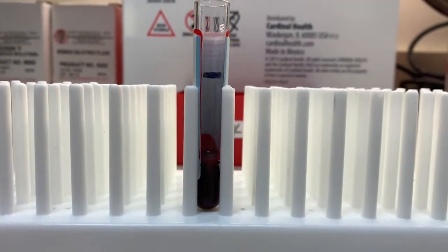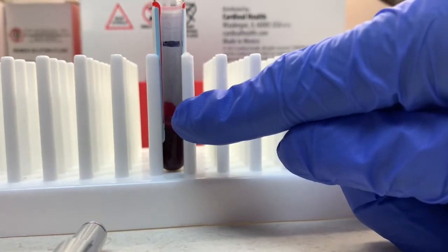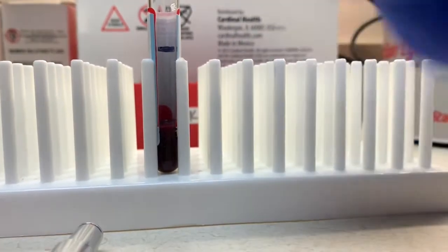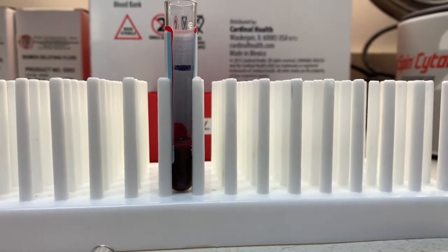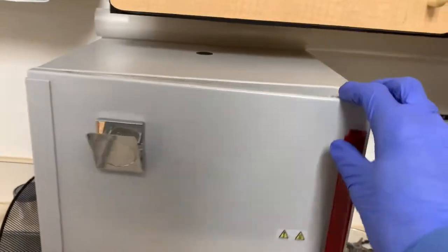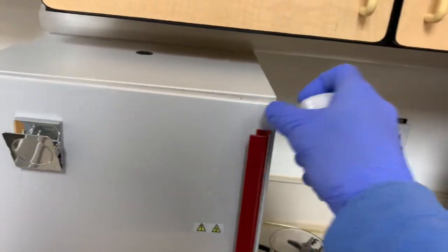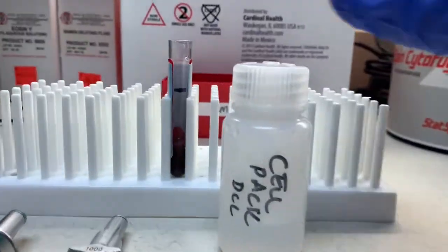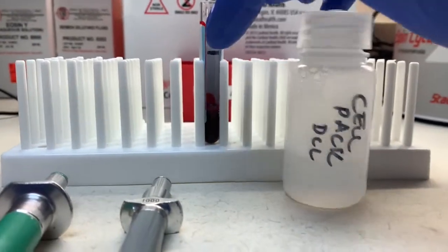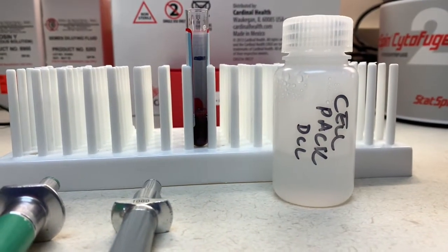So, while removing the plasma with the pipette, you need to be very careful not to disrupt the buffy coat layer here. You can actually take off some of the platelets by accident. So once you've got that done, in your incubator, hopefully, you'll have some of the cell pack solution that we use for the analyzer. It's pre-warmed. And you'll use this to volumetrically replace the exact amount of plasma that you've taken off here, right back up to that line. So I'm going to go ahead and do that now.